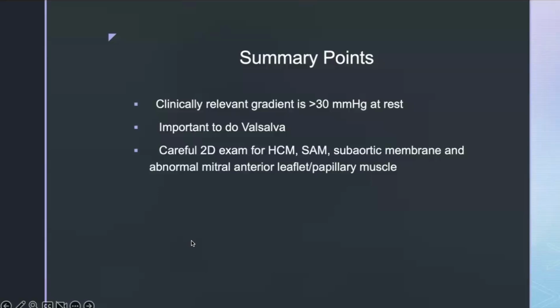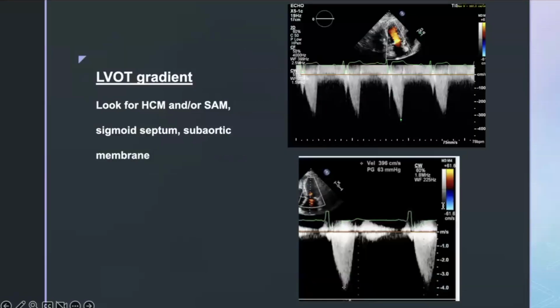And then if it's not, we kind of resort to the fact that it's due to one of those other unique conditions. So hyperdynamic LV, small LV cavity, hypovolemia. And then we can feel more confident, as the readers and as the sonographers, all of us, that it's less pathologic or there's less outcome-based effects on the patient. And so, again, just some things to look for.